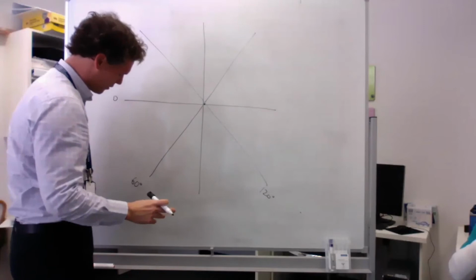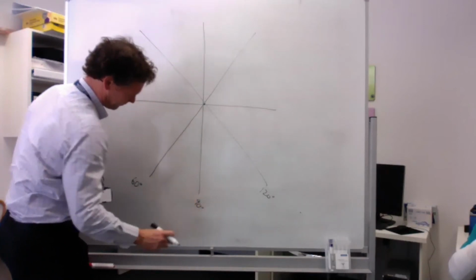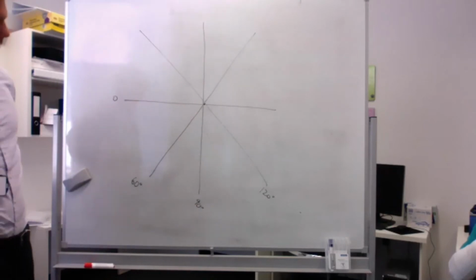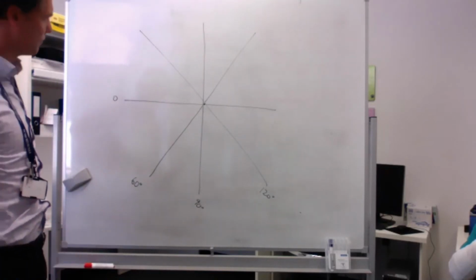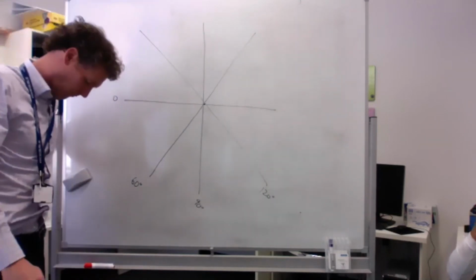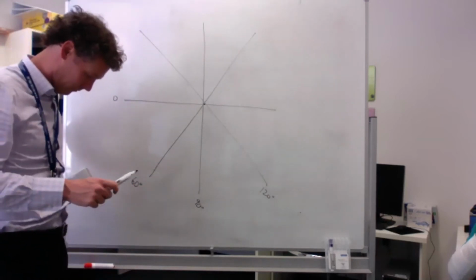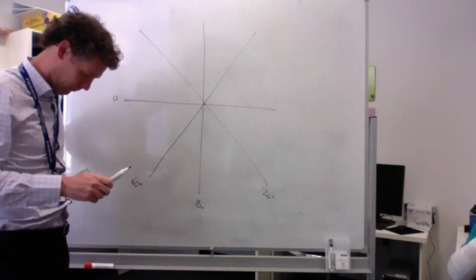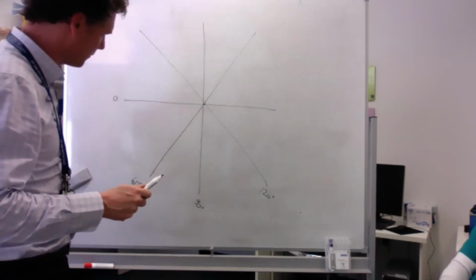Okay, how about 2-chamber? The 2-chamber goes through A1, and no, that can't be right. I had it as going through A1 and P1. No, that must be wrong. I'm going to find my picture again.